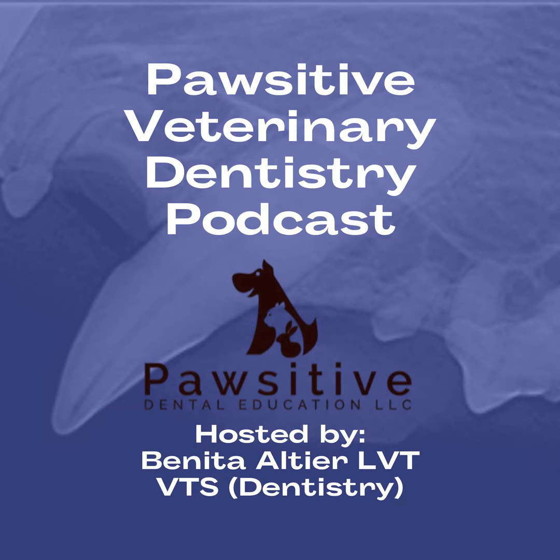And I also really appreciated that you mentioned don't even start down the path of looking for pathology or interpreting until you're sure that you've identified what's in the picture, that the image is oriented correctly. Because I feel, and I'm sure you do as well, that we shouldn't start interpreting images that are oriented upside down on the screen, or we never want to flip images either way, but we want to be very sure that we can identify maxillary versus mandibular and not necessarily depend on any labeling on the image, because potentially the labeling could be incorrect. Absolutely.